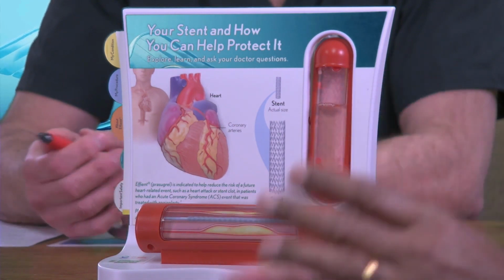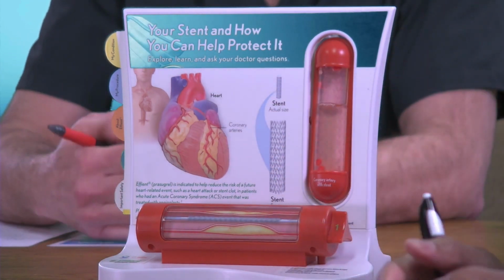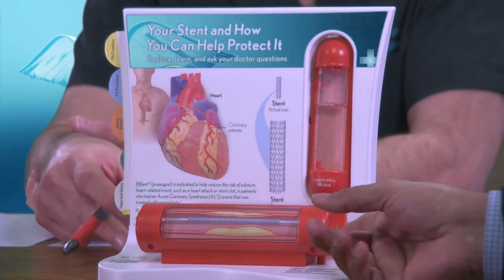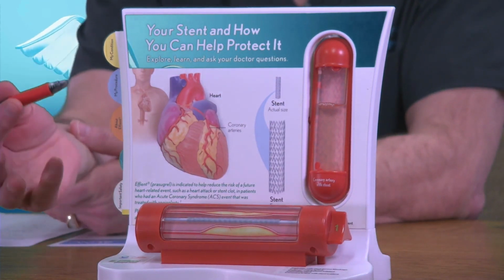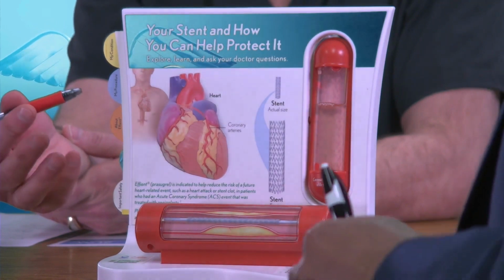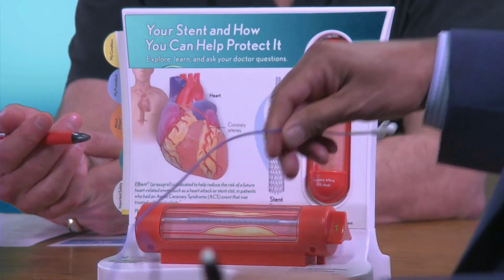So there are two kinds of chest pain. One is called stable angina. When they exert themselves, not enough blood flows, they start getting tightness and heaviness in the chest. Let's stay zoomed in on that if we can for a little bit longer. Then we can put a wire through there and then stent it, and boom. So that's two steps. The first step is to put a wire in there, and you can show us one of these wires in a second. In fact, stay zoomed in, and he's going to show us a real wire that's used.